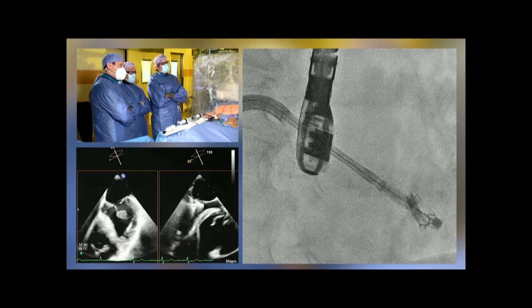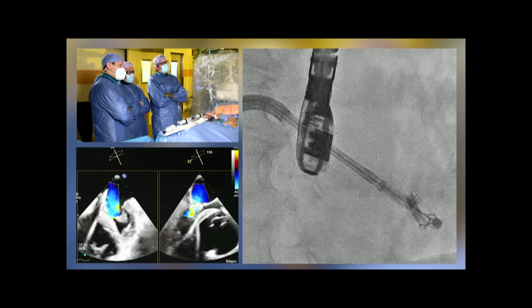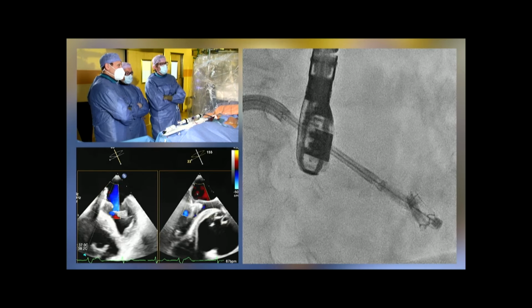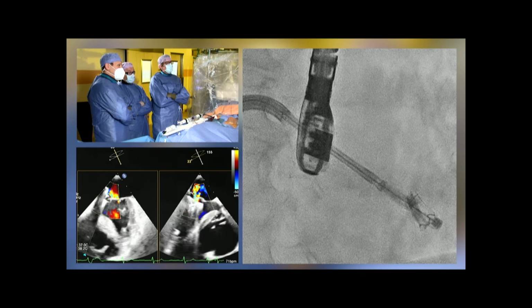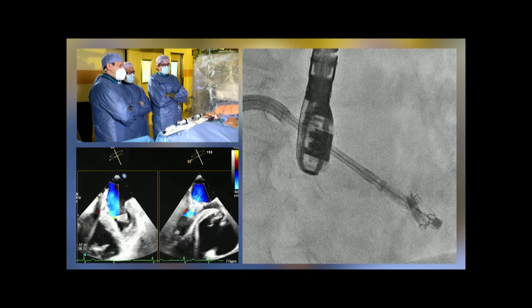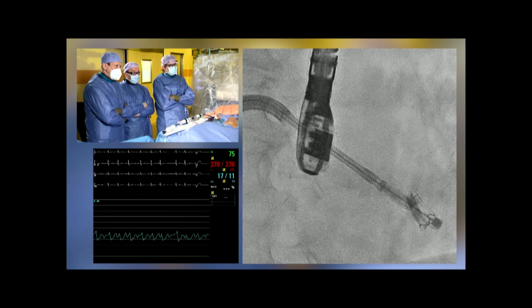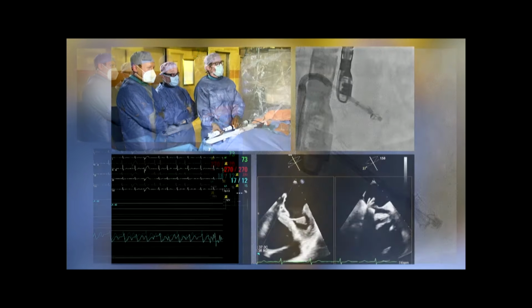Can we see color here, please? The V wave, I think, is very interesting. It's almost gone. That's why I wanted to see color. So I think the pressure tracings there are reliable. Okay, can we add pressures to the view as well, please? Wonderful. Yeah, I think this is very impressive. If you see, the PASCAL is not closed, it's still in its open position, but the V wave is almost completely gone. Well, let's try that.